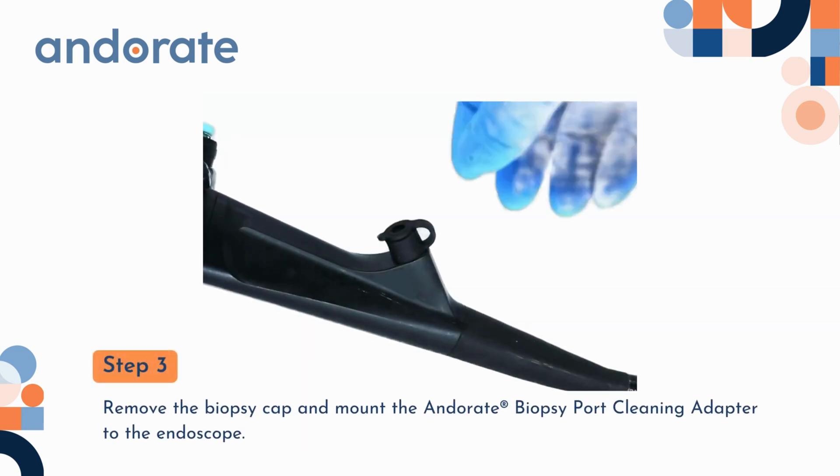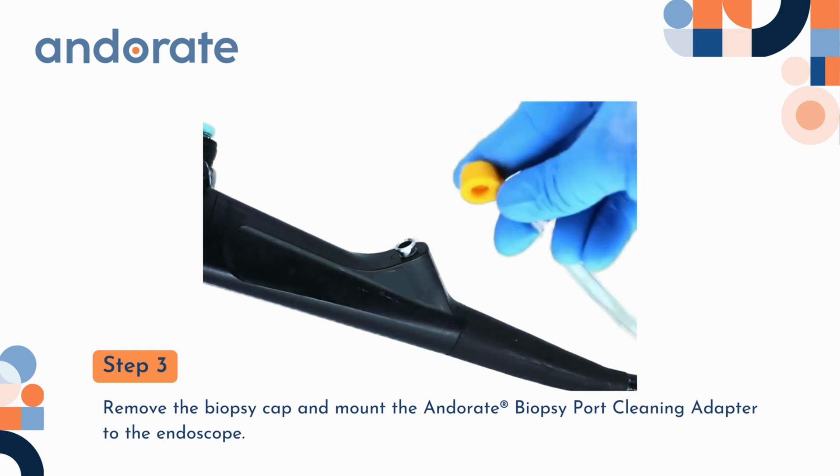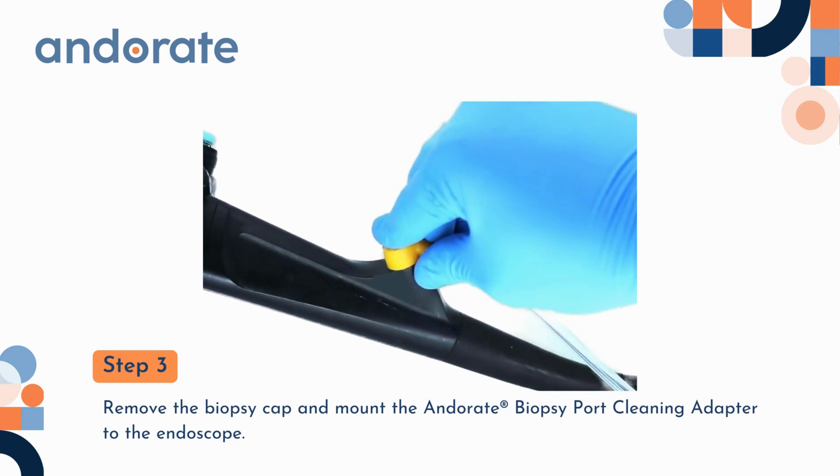Step 3. Remove the biopsy cap and mount the Andorate biopsy port cleaning adapter to the endoscope.